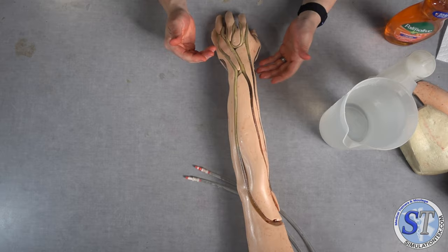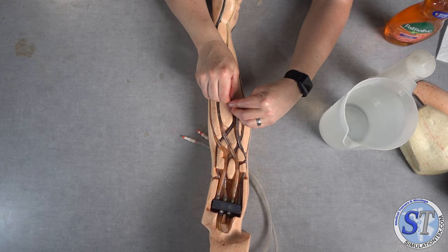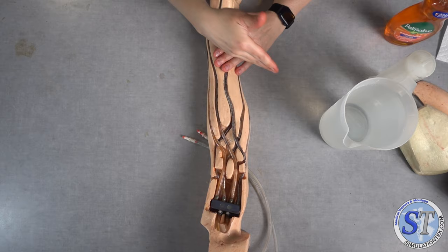At this point, what I tend to do is try to look and see where there could be a clot. So what I want to do is look at all the tubes and see if something's kinked. If I open it up and you'd have a bend in here or something like that, that's where your problem is. And you can actually do flow tests and try to get this to work. But this had enough sticks in it that I think I'm done with these tubes. So I think I'm just going to let it go.